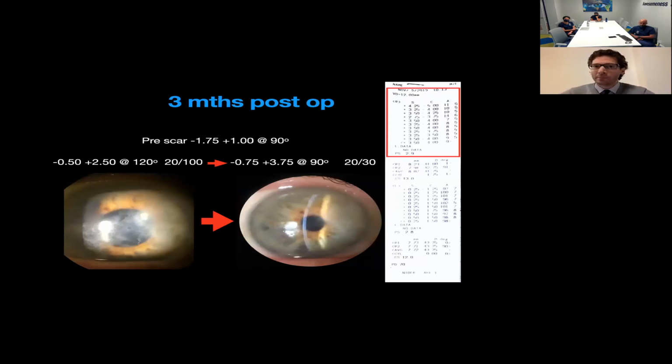I did 100 microns. Okay, and so can you tell us more about what the masking agent is that you use and how you use it and how long you wait for it to dry, and what do you do exactly? Yeah, I actually used HPMC. It's an artificial tear, 0.7%. I like to use that one because it is less viscous.